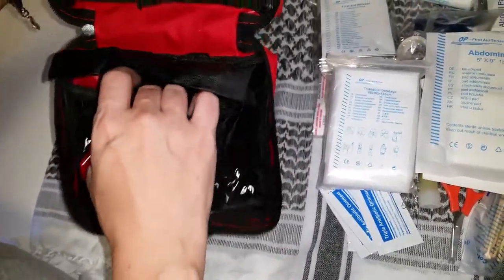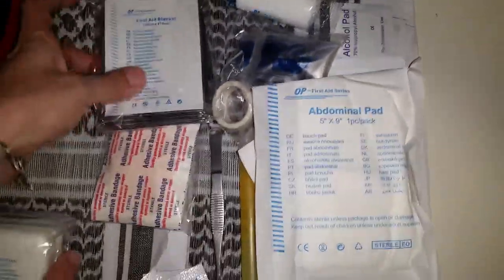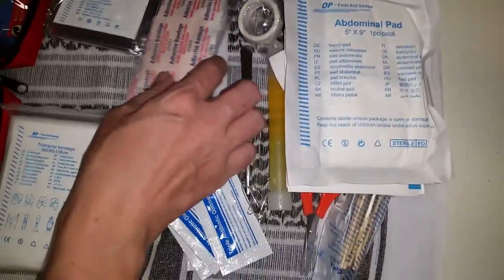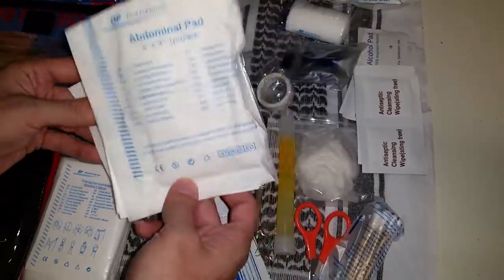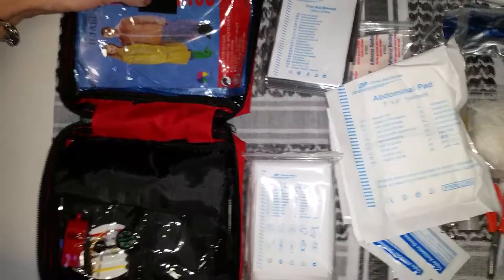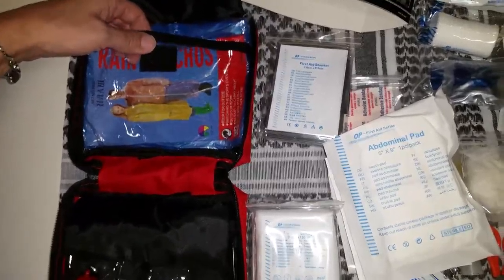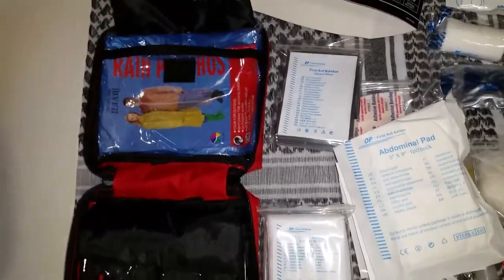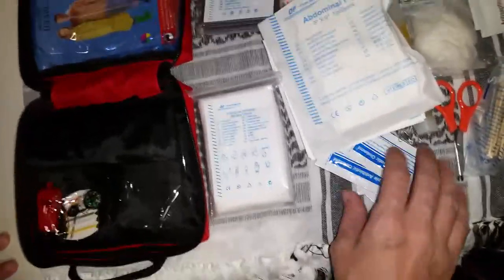They cram a lot in here for the size. I really didn't think they would be able to get nearly as much as they did in such a small kit, so I'm pretty impressed. The only thing I would do is put an extra set of gloves in there. And there's still just enough room if you want to personalize it — if you know you have a camping trip or a road trip, you could take a little resealable sandwich bag and stick some prescription meds or some Tylenol or anything in there for your trip.